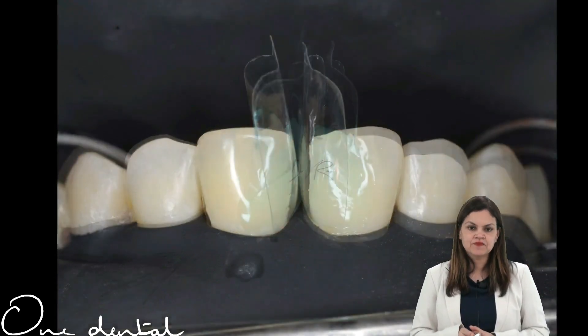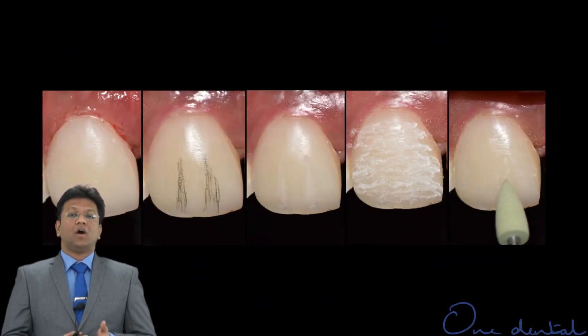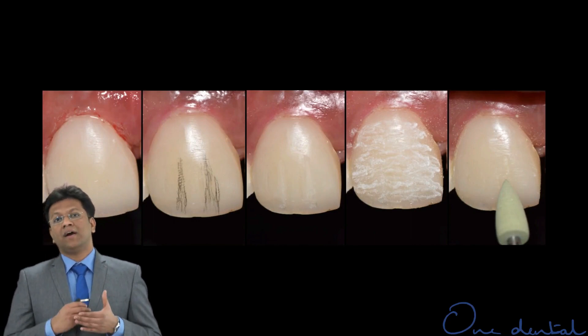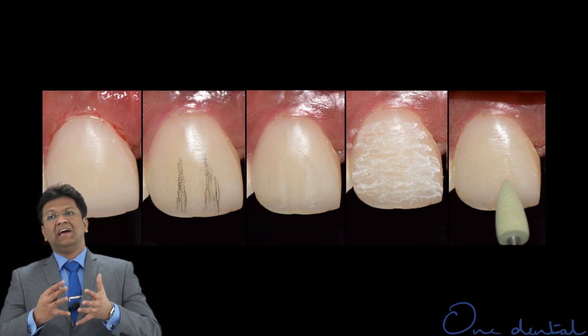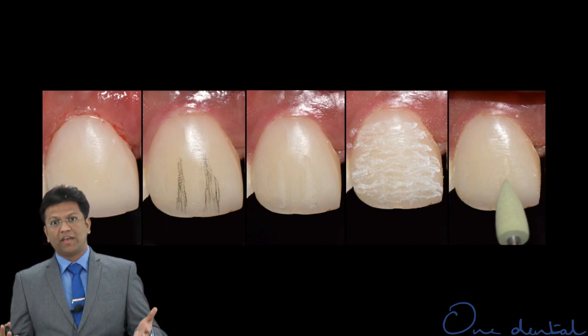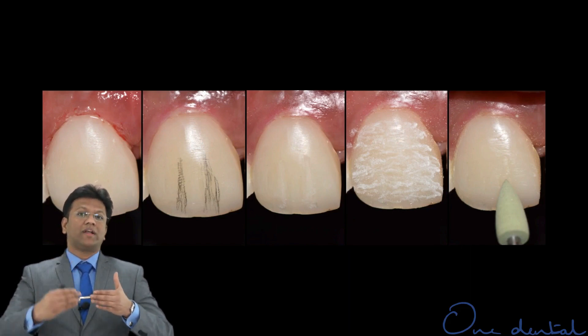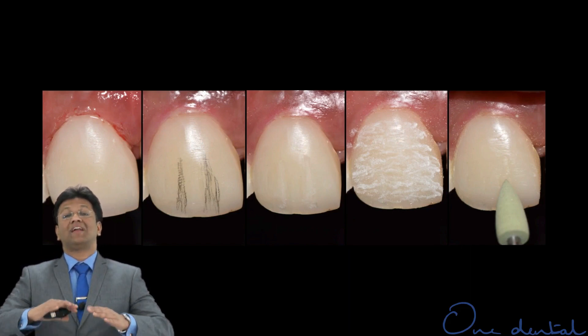The bonding agent was applied and cured. Once all of this has been prepared, the restorative composite surface becomes quite rough, and you need to reduce the roughness and blend whatever anatomy you have created with the rest of the composite restoration.